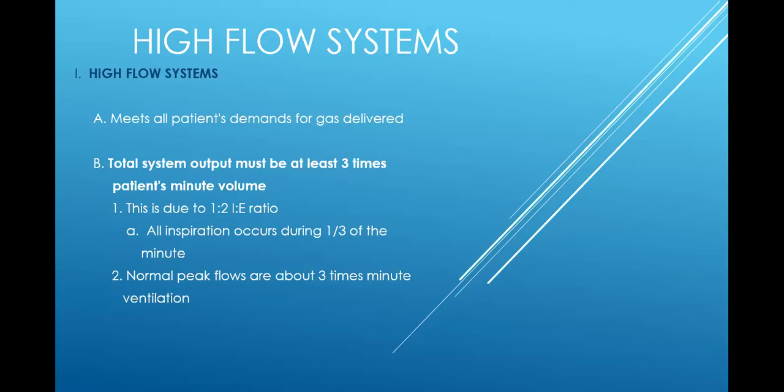So outside your window is 21%. Inside your car is 21%. But sometimes they need that extra flow. Okay, and so that's what we call a patient being air hungry. When a patient is air hungry, you need to increase their flow. If you see he's struggling to get that breath, increase the flow.